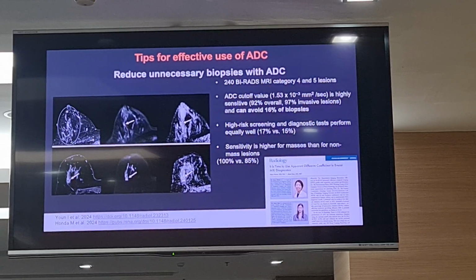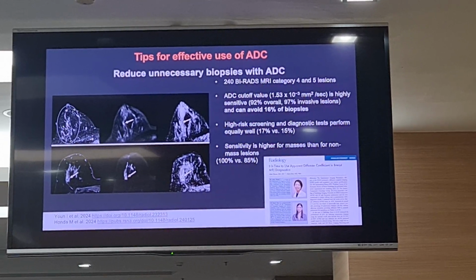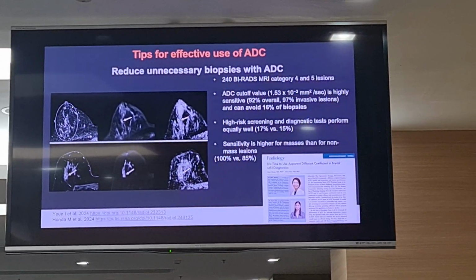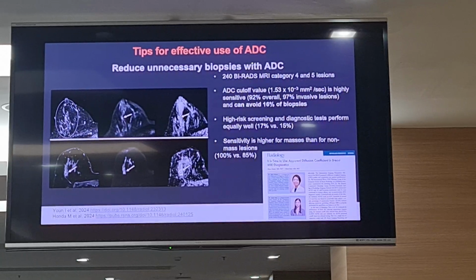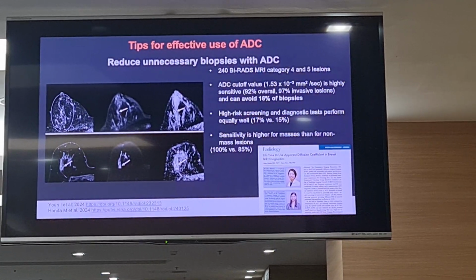With my colleague, we wrote an editorial that now is the time to use the apparent diffusion coefficient in breast MR diagnostics. So now the time has come, hopefully.